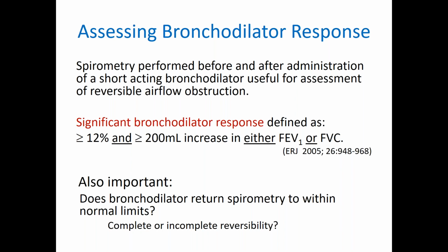The other important aspect for assessing bronchodilator response is that if we do see a response, to describe whether the bronchodilator actually returns spirometry to within normal limits or not. So is there complete resolution of any airflow limitation, or is there only partial reversibility, so there's incomplete reversibility.